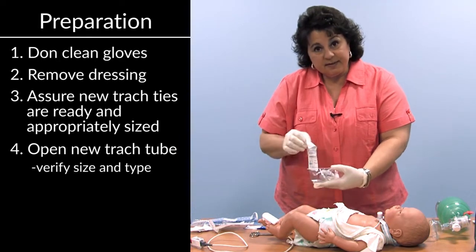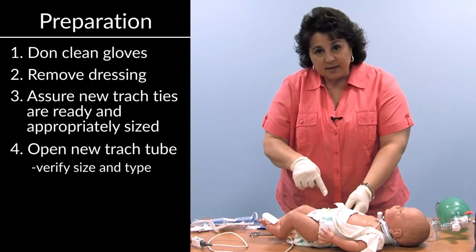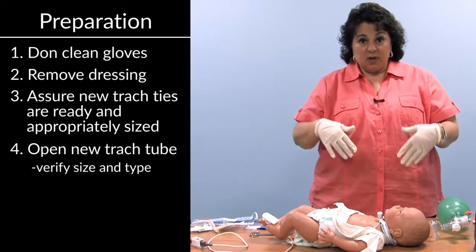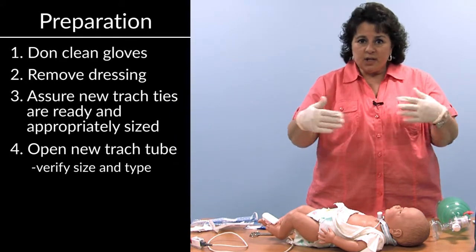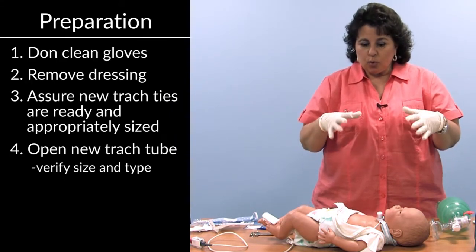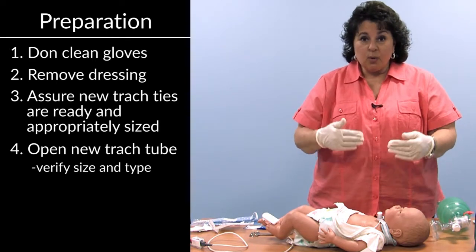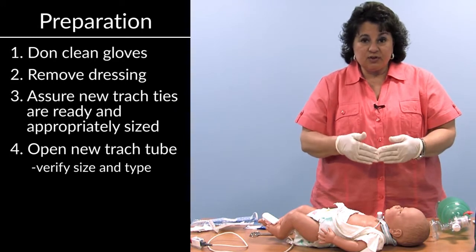I've verified the size and that it is cuffed. And something called the timeout procedure is used within the hospital setting, and we have two people verify who we're changing the trach on, and do we have the right tube. So it's very important when you and the other person are getting ready to change the tube.